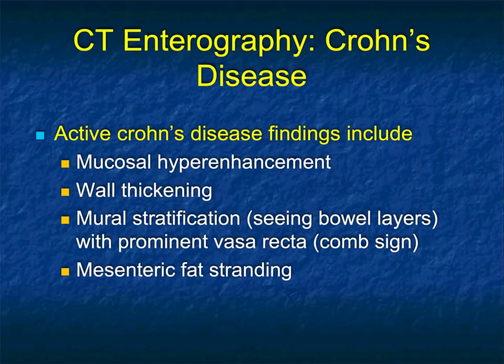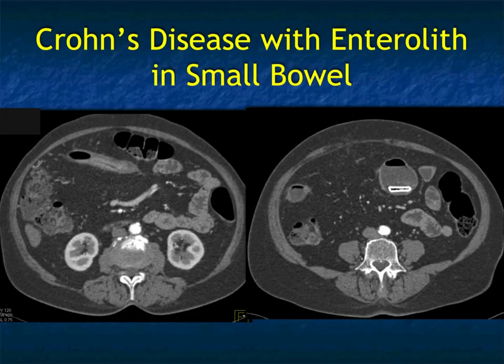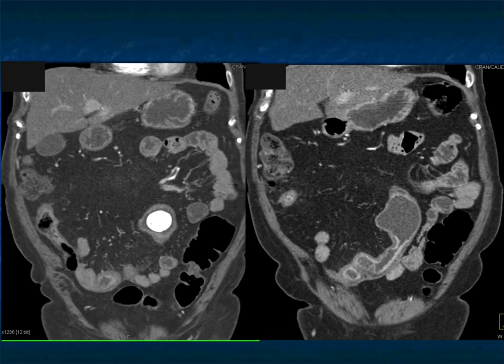Now looking at small bowel, we often do dedicated small bowel studies called CT enterography. In Crohn's disease we look for many things: mucosal hyperenhancement, wall thickening, the comb sign with prominent vasa recta, mesenteric fat stranding, and changes in vessel caliber. Here's a good example of dilated bowel with an enterolith. One of the complications of Crohn's — when you think about small bowel obstruction — is strictures. You can see the enterolith beautifully here with that thickened bowel.